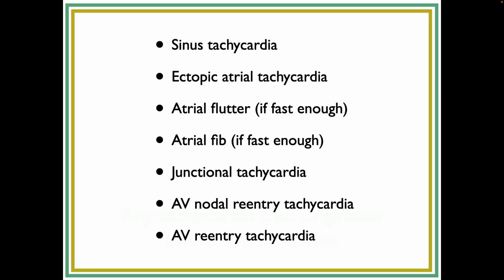So let's look at my list here. So these are all the rhythms that either by definition are tachycardic or like AFib and aflutter could be tachycardic that originate above the ventricles. So just hold on a sec. So here they all are. Now this is one use of the term supraventricular tachycardia.